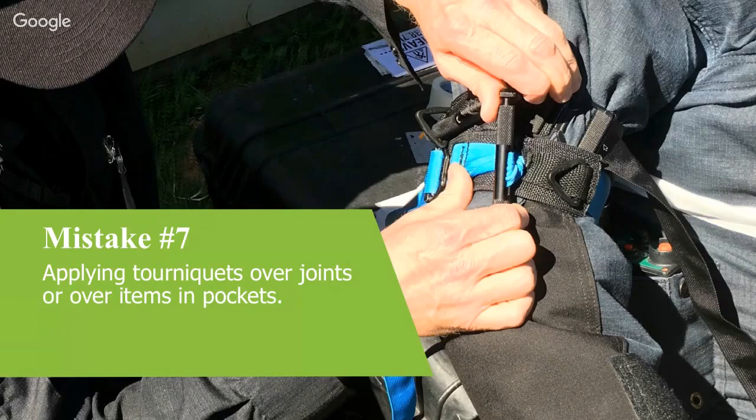But we will say that the TCCC guidelines state that for that initial tourniquet application, we are going to place it over their clothing or over their uniform. And then later on, we can convert that to directly on the skin. We know that with a large amount of uniforms, say winter, where you may be wearing thick clothing, lots of jumpers or pants, it may not be as effective, or you may require further twists to have that effectiveness of the tourniquet. I mean, we see in the photo on the slide there, that's actually a bomb suit from a law enforcement agency, and there was talk that you could apply a tourniquet or multiple tourniquets, or even with a soft T, join two of them together, and that would occlude the blood flow over top of a bomb suit.